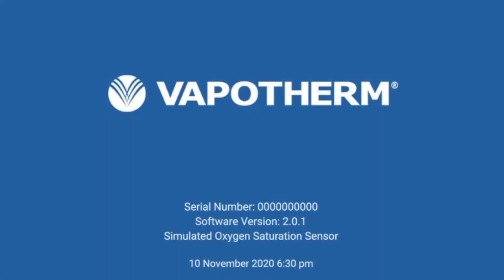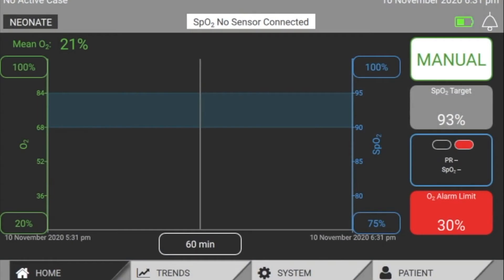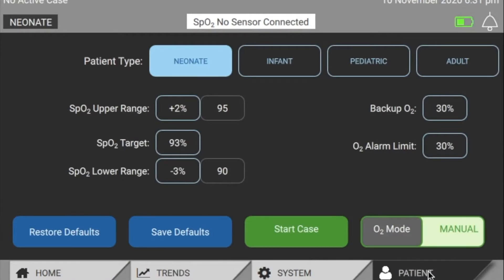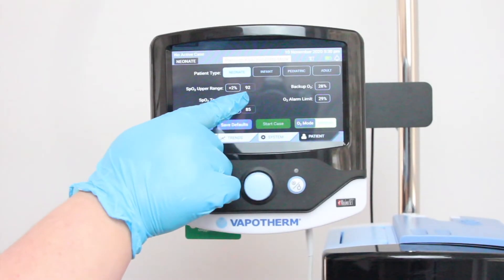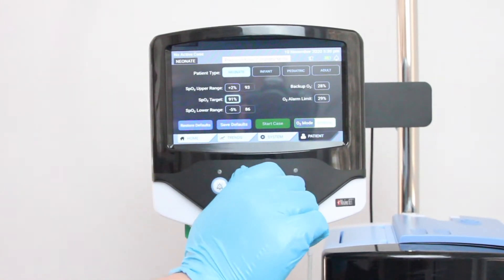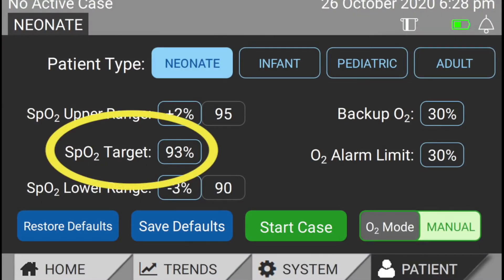The OAM will boot into the home screen. The first thing you'll want to do is go to the patient screen, where you can enter all therapy, backup, and alarm settings. You can choose between four patient populations. These patient populations impact the preset defaults only and do not impact any behavior or functionality of the algorithm itself. To change any settings, touch the parameter box using the touchscreen, then use the blue control knob to adjust the value. Let's start with the SpO2 target — this is the target that will drive the controller's decision to adjust the O2, and it is the foundation for the therapy.